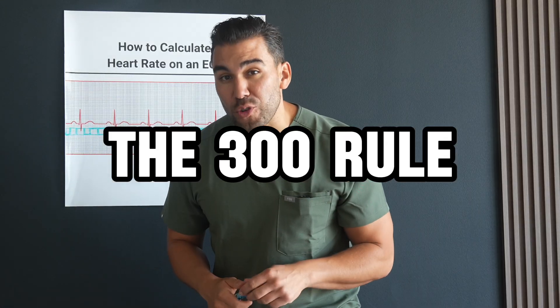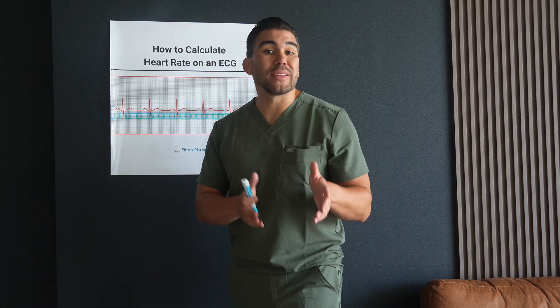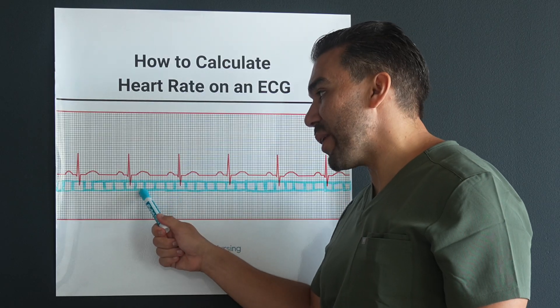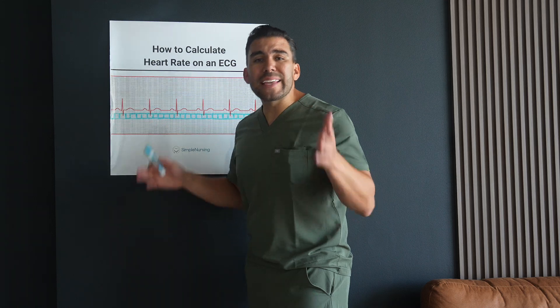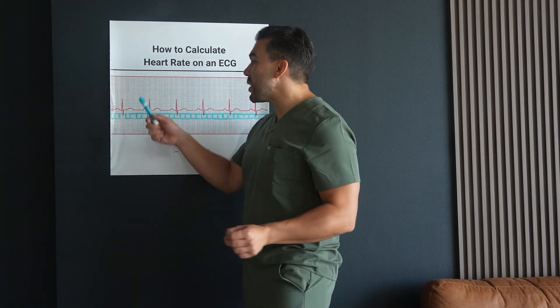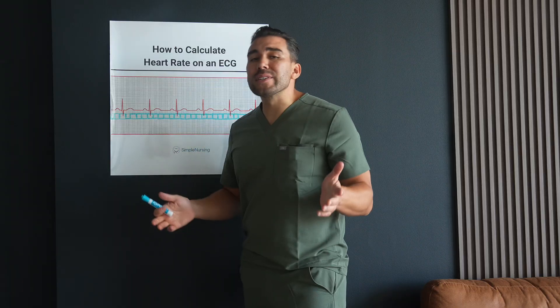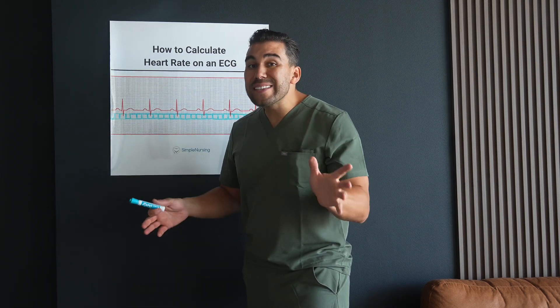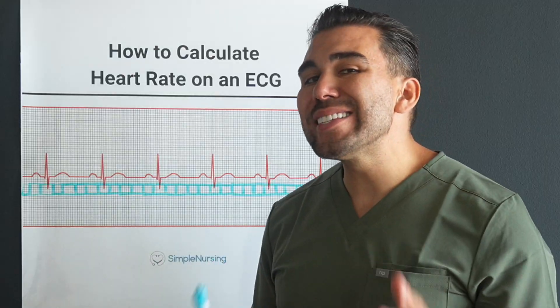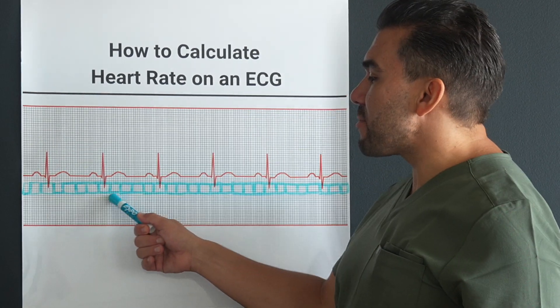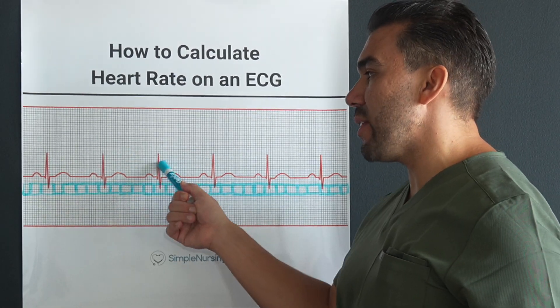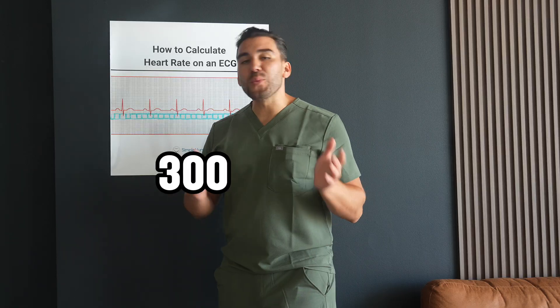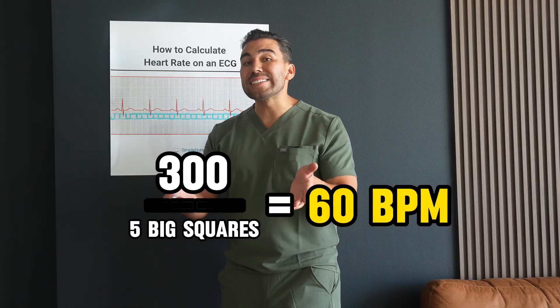Today we're going to explore three main methods to calculating the heart rate. Let's dive into the 300 rule — this is a quick way to estimate the heart rate for regular rhythms. You can see the clearly marked big squares in blue here. We simply count the number of big squares between two consecutive R waves and divide 300 by that number. In this example, there are about five boxes between the R peaks, so 300 divided by 5 is 60 beats per minute.